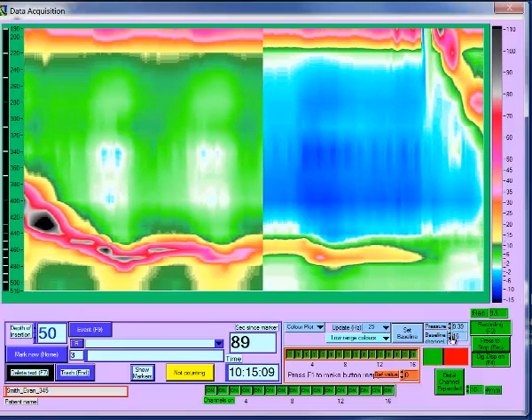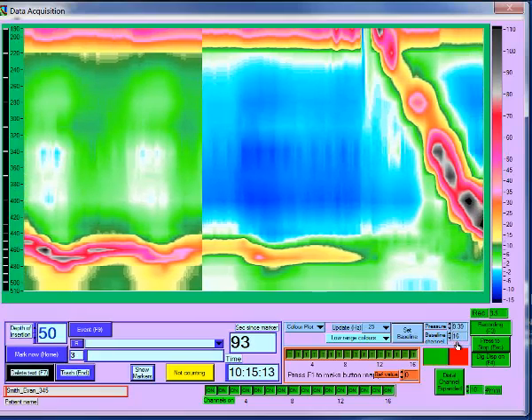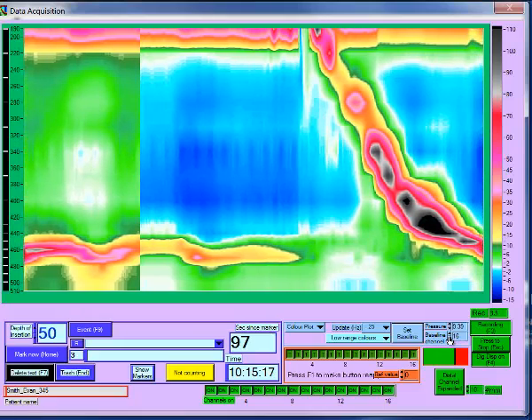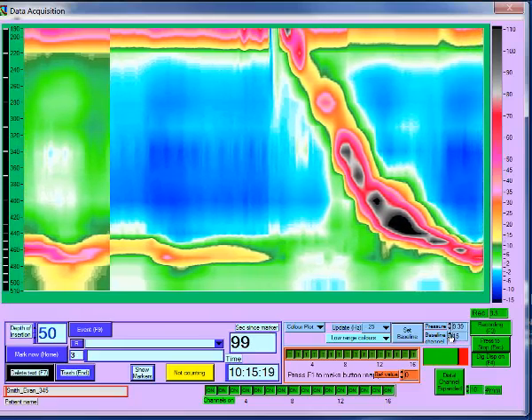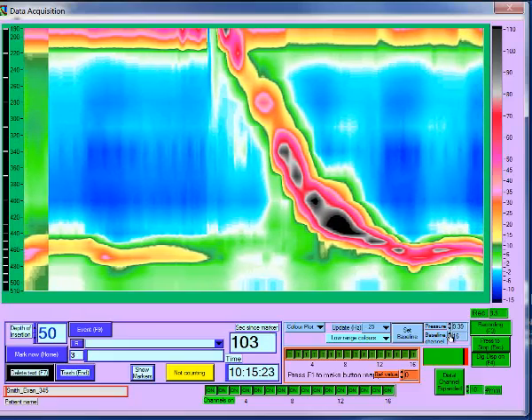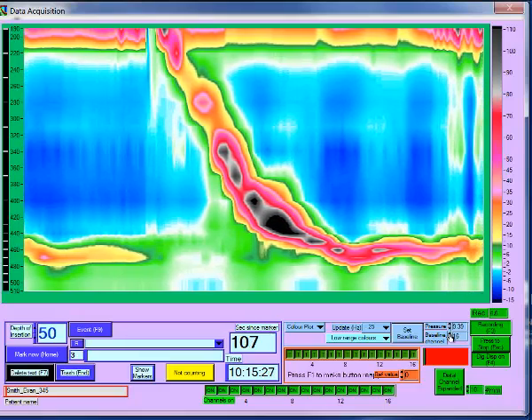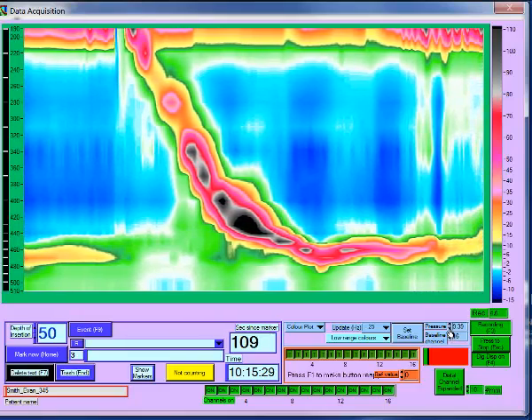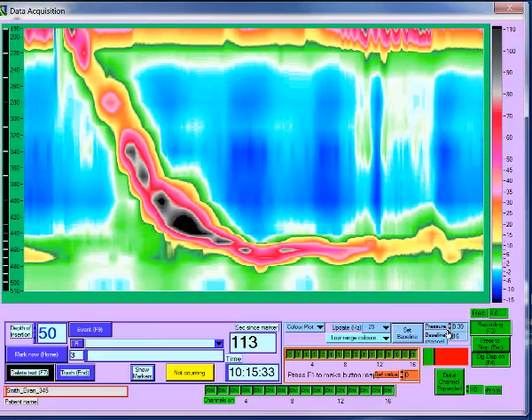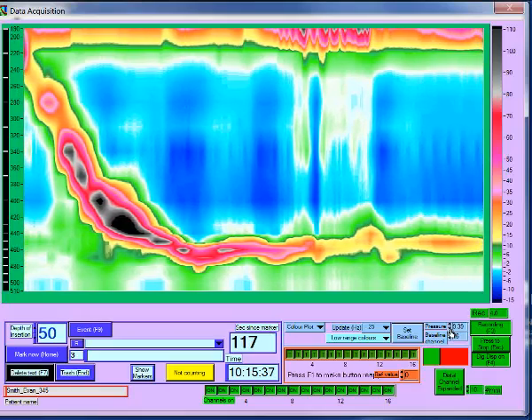The baseline channel can be adjusted and should be the channel which is in the stomach. You can do this using the numeric control, but generally it will be channel 15 or channel 16 in esophageal manometry. The baseline pressure that is currently used is displayed above the baseline channel.